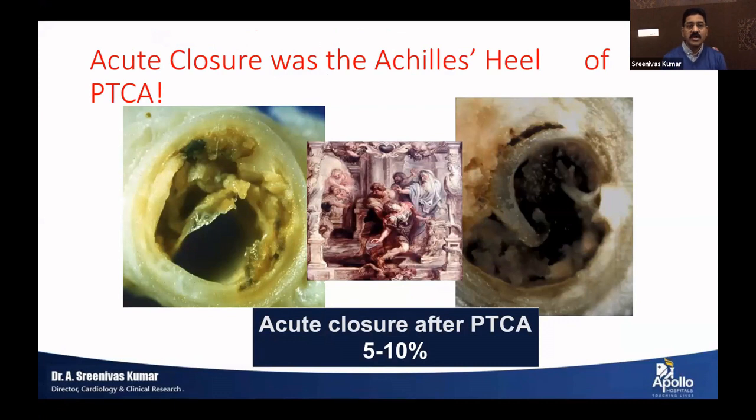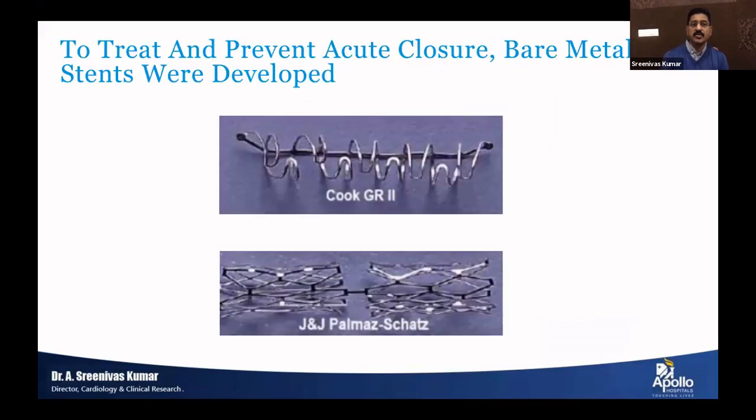But the thing was, when the balloons were done, the vessels were getting closed. So a lot of times we were forced to sit with the patients as residents. If something happens, we have to address it immediately. In those days, perfusion balloons were also used. We were thinking, we have to avoid this acute closure. That's how stents came.